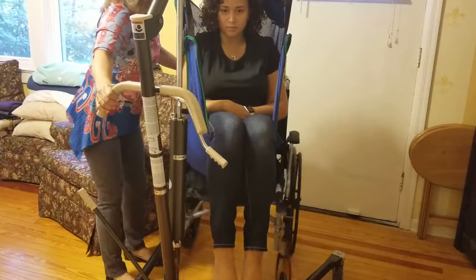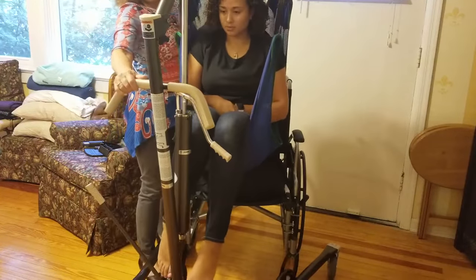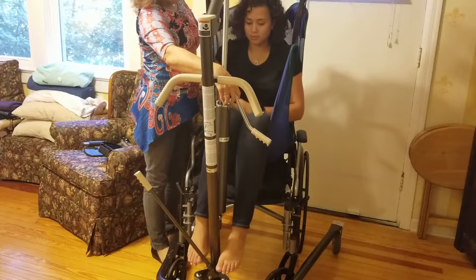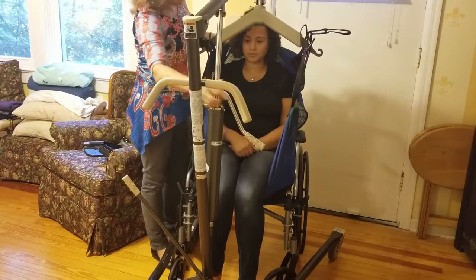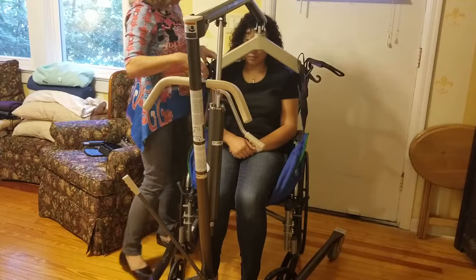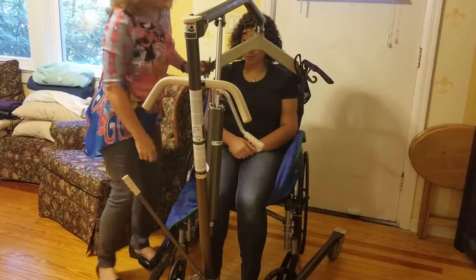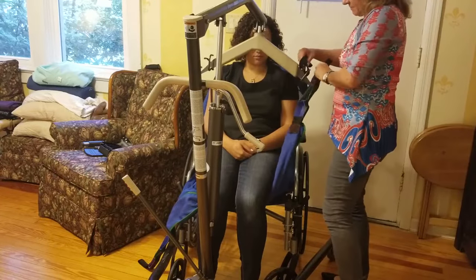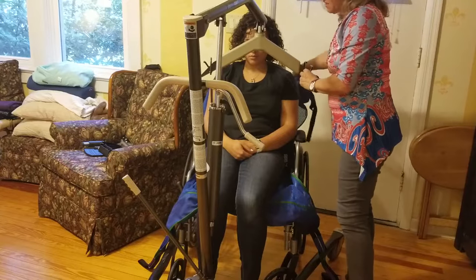Adjust the chair position if needed — get behind the chair or close enough and push the patient all the way back. Then gently push the black knob and she comes down off the lift and into the chair very smoothly. Once they're seated, take the sling off. The person can stay sitting on the sling until you're ready for them to go back to bed — then you just reverse the entire process.